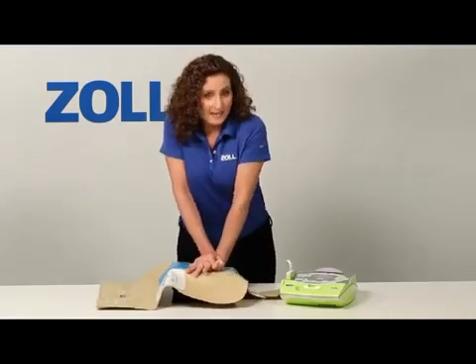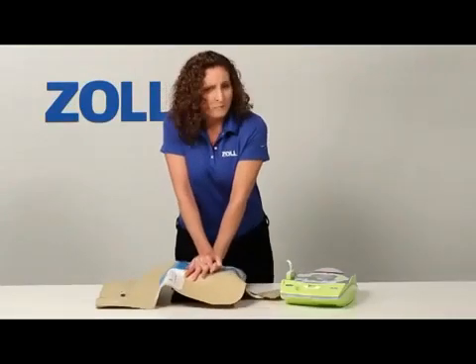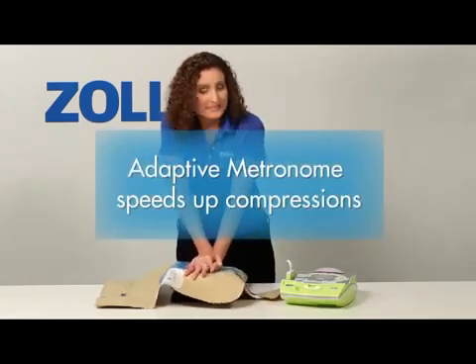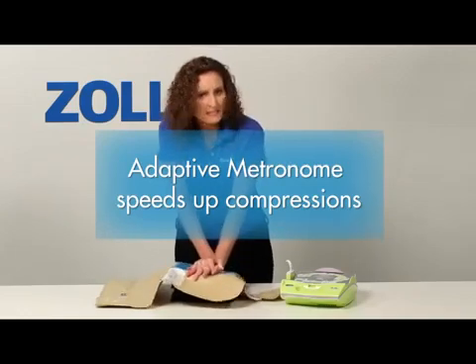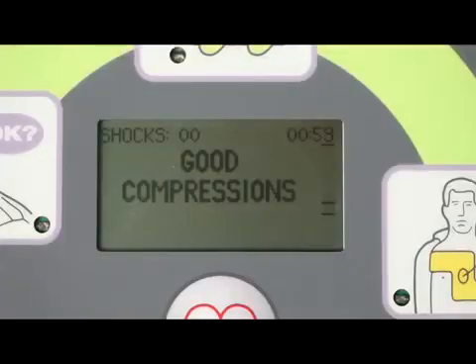Notice the bar gauge on the display as I start chest compressions. Push harder. I am not pushing hard enough. The beeps act as an adaptive metronome that monitors my compressions and tries to speed them up to at least 100 per minute. Good compression.